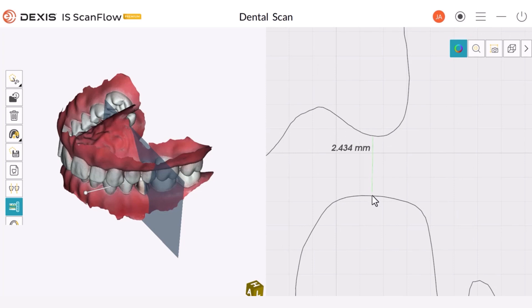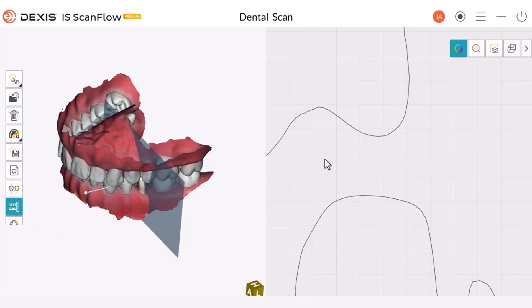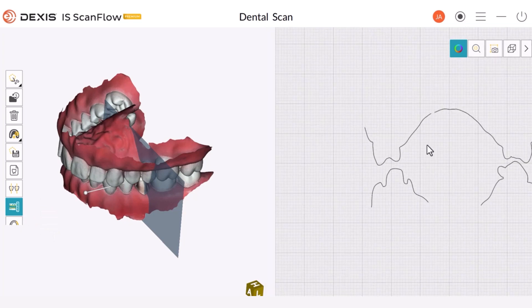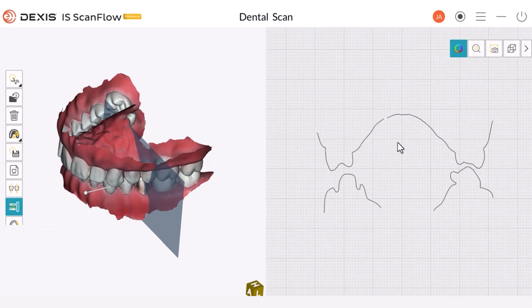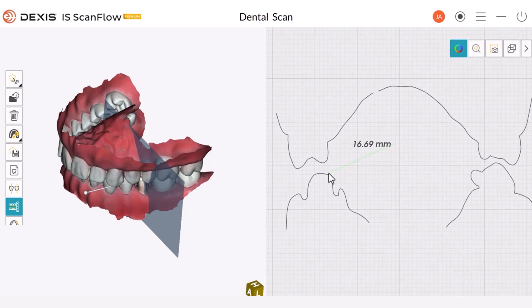Here we have a 2.4 millimeter measurement. As you can see, these squares represent millimeters. If the measurement is overlapping another, you can remove it by selecting Restore. I will now measure a different area that I can read better and take a screenshot if needed. You can Restore and Reset all of it using the Restore and Reset buttons and roll the mouse wheel to zoom in and out. To reposition the slice in the viewing area, right-click and drag. To start measuring, click the left button. I will now reset everything and click the Occlusion option to disengage it.